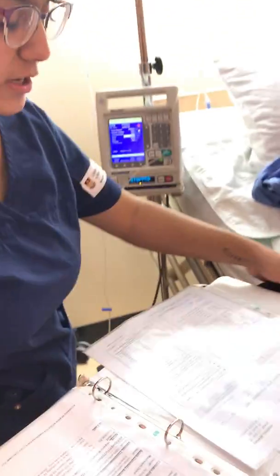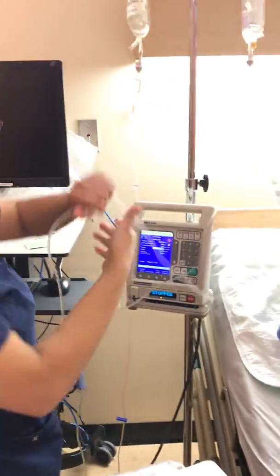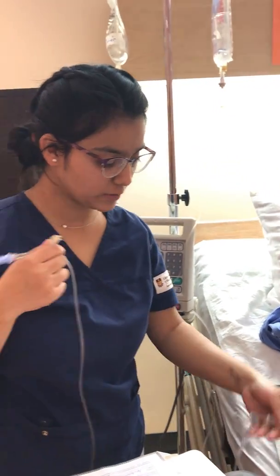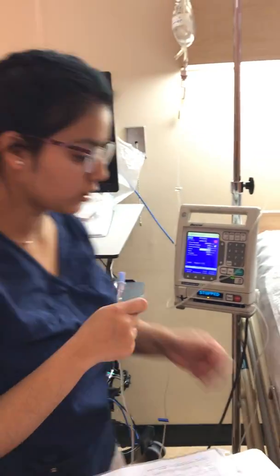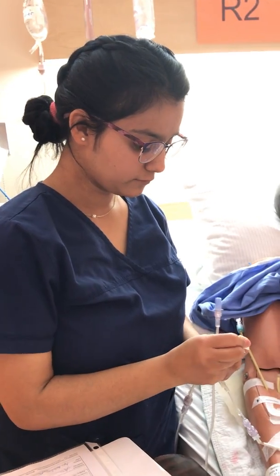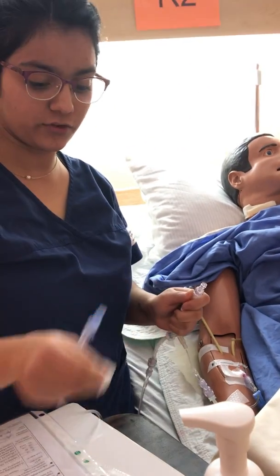Once everything is ready and matches what I have in the pump, I'm going to take my tubing. My buddy nurse has already primed the white tubing for me, so all I need to do is alcohol swab it. We're just going to take this and alcohol swab for 30 seconds and dry it for 15.